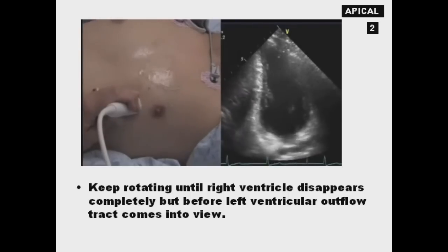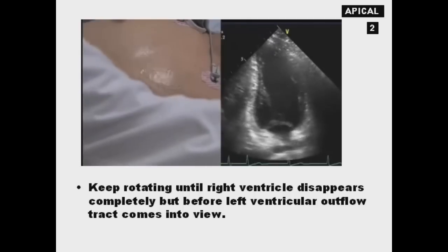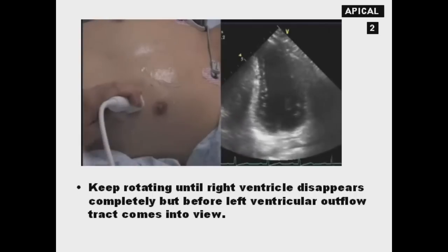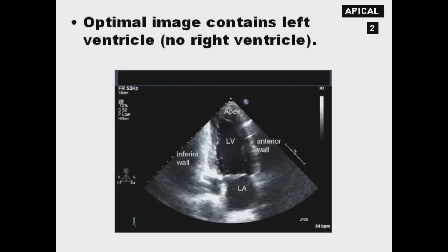One of the things you can adjust as well, as you can see here, is our focus. So if I'm not seeing the apex well, I can move my focus towards the apex and then often increase the gain a little bit, and now it may be a little bit easier to see exactly where that apex is. The right cavities must not be in this view.